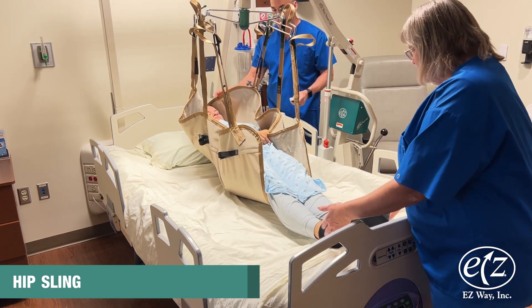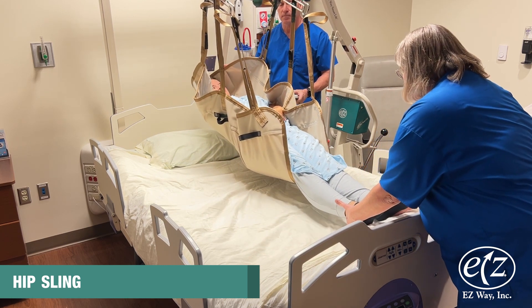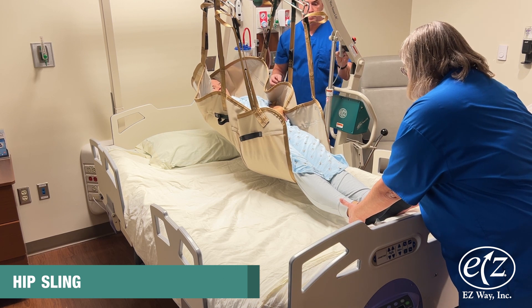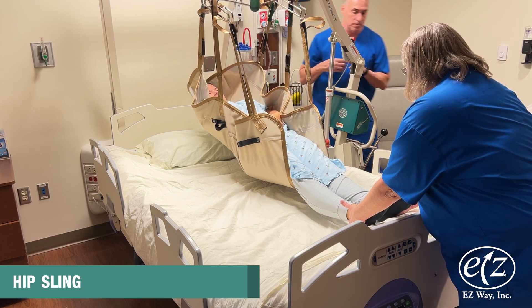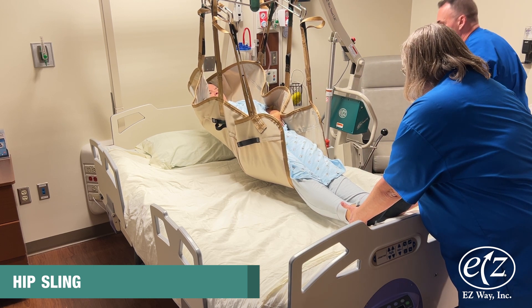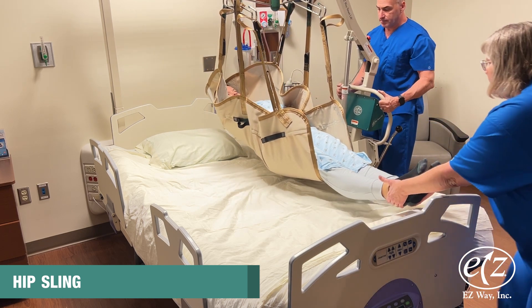Continue to raise the person until they have cleared the surface. Note the knees will bend. Make sure to raise the person's feet if needed to help clear the surface. Maneuver the lift to complete the transfer, raising the feet if needed to clear the surface to which you are transferring the person.